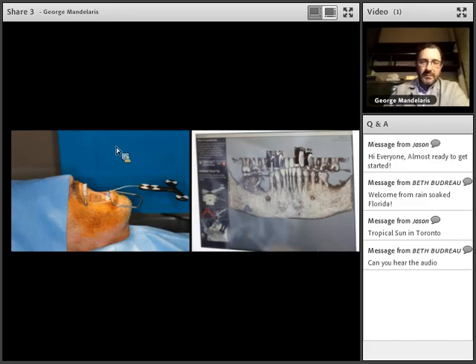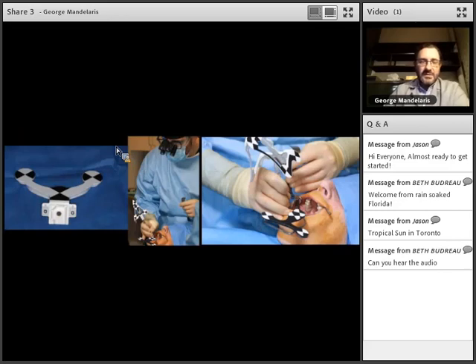There's the jaw tag in place. And now I'm using the tracer tool. I've selected my 4 reference points, and now I'm going to trace those out. So we use the jaw tracker here, the jaw tag, as you see there on the left-hand side. The calibrator that we were using earlier has been updated to this model here. So I'm registering that. I'm tracing, as you can see, which is essentially a contact map. We're contact mapping 4 points and 100 points per tooth.